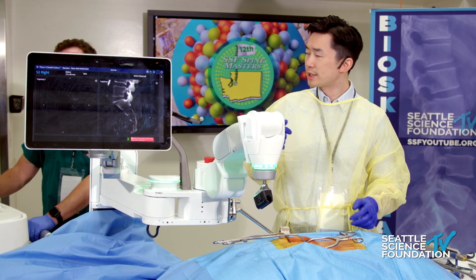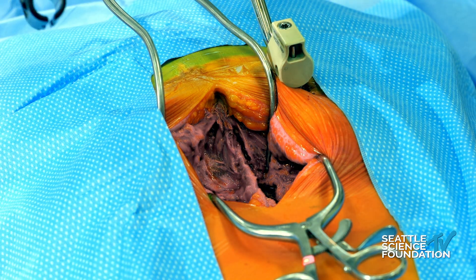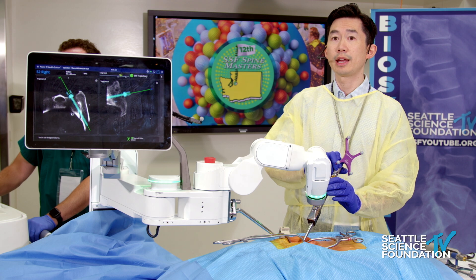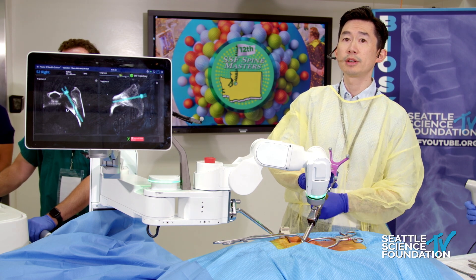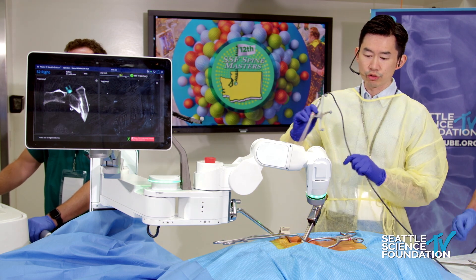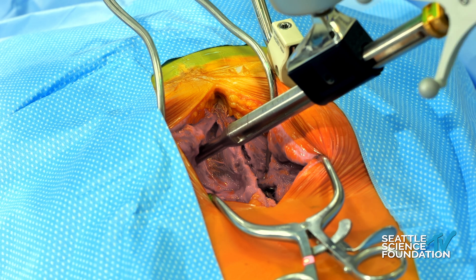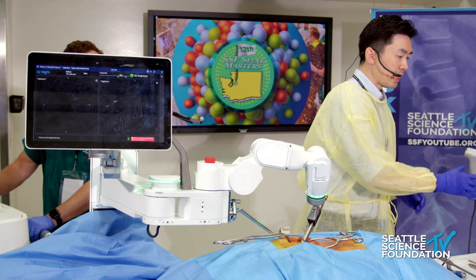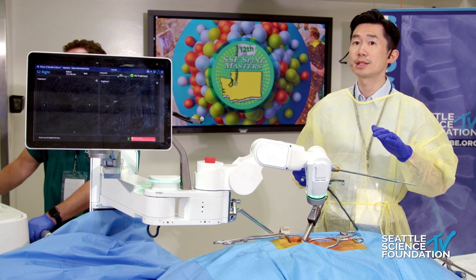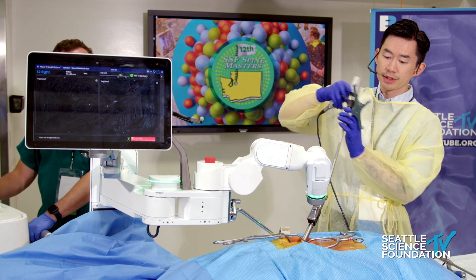So you can go ahead and send it to the trajectory. For this particular cadaver — head is over here — I'm going to be placing a right-sided S2 ALI iliac screw. The first thing done is the navigated cannula and dilator. You can see good apposition of the trajectory of that S2 AI screw. Next is the decortication drill, which drills down that path with navigated guidance down the cannula. Next step is the tap — you can use a 4-5 or 5-5 tap — the idea is to get across the SI joint.